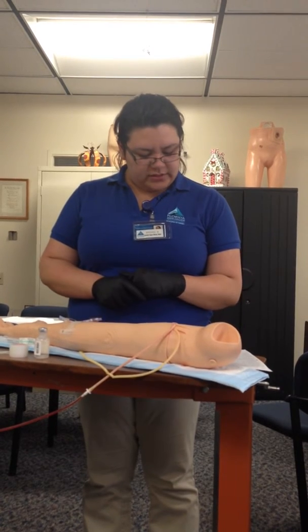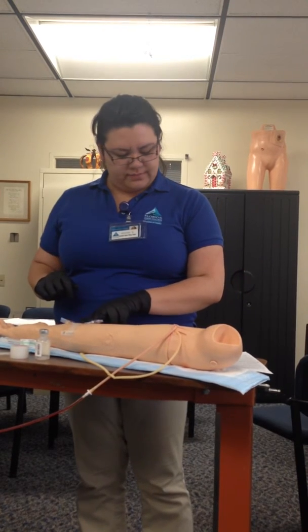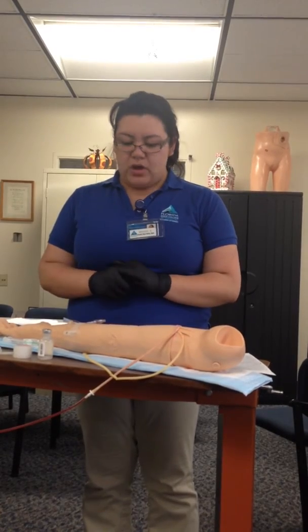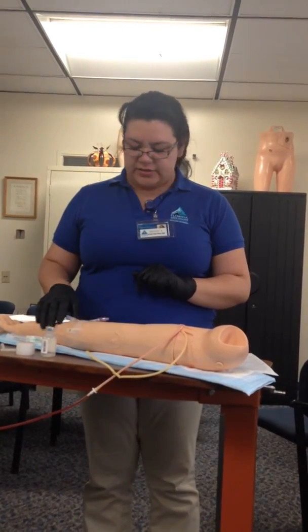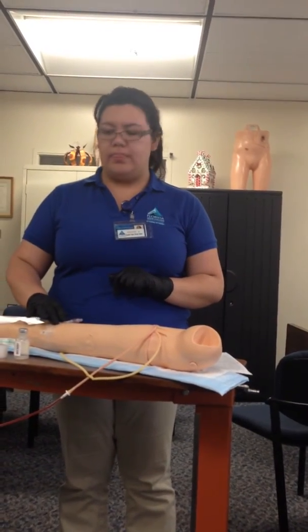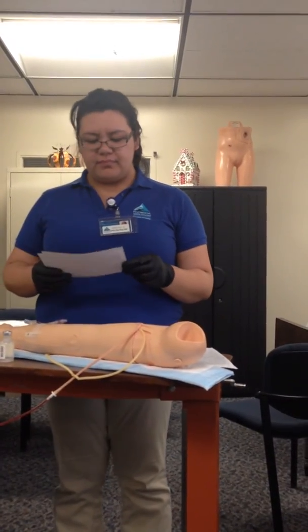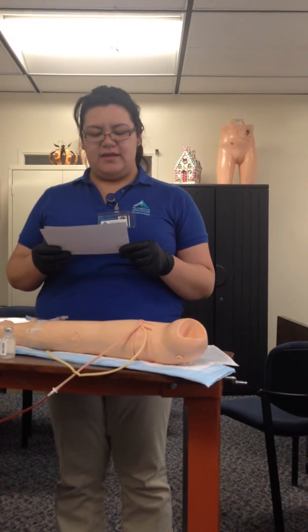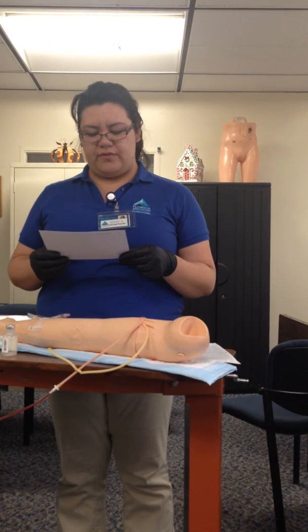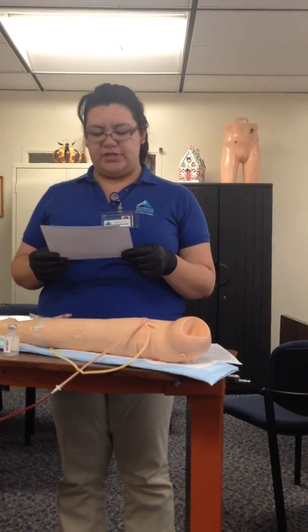And I would dispose of all my needles and syringes in the sharps container. And I would monitor the site for edema, pain, tenderness, and any allergic reactions. And on my MAR, I would document the time, dose, and route, and state the condition of the IV site when I left the room: the time, the date, the dose of 500 milligrams, the drug, vancomycin, into the right forearm peripheral IV, the condition of the site with no redness, swelling, infiltration, and phlebitis.